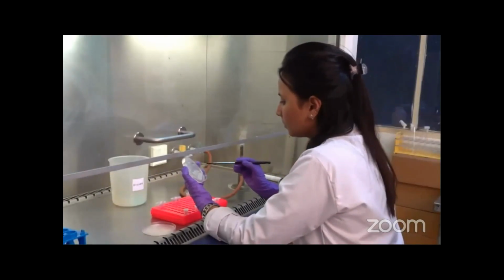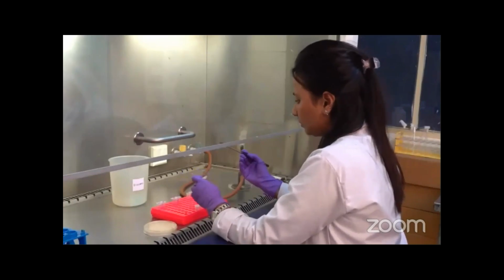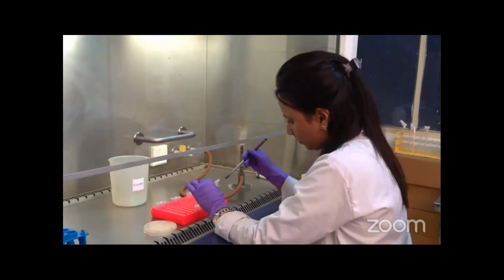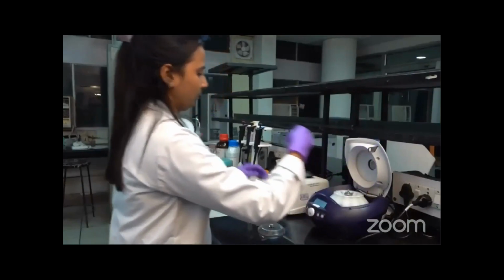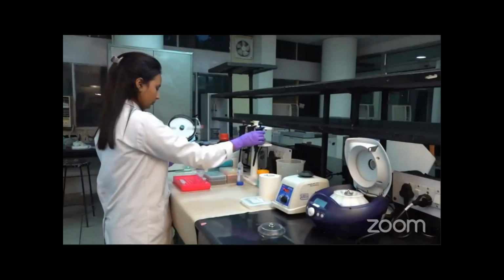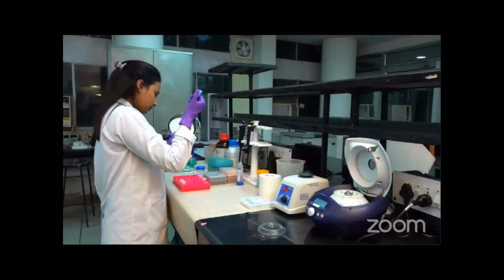Remember, the yeast to be identified should be a fresh growth, usually 14 to 18 hours. We take 3 to 5 single colonies using a sterile loop and resuspend them in 1 ml of double distilled water. This is then vortexed to wash the cells and remove any impurities from the media or unwanted proteins which could interfere with the MALDI result.